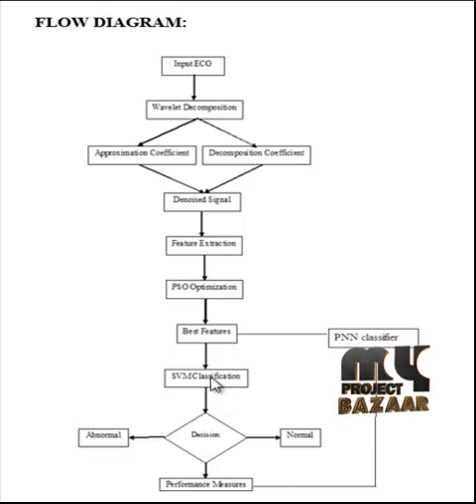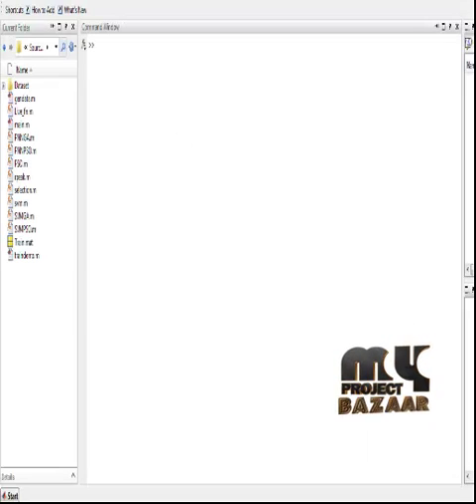For the classification process, two classifiers are used: SVM classifier and the PNN classifier, and the performances of these two classifiers were measured. For both classifiers, the decision is whether the input signal is normal or stress signal. From the values calculated, we measure the performance of the process based on accuracy, sensitivity, and the specificity of the classification process. Let me see the running procedure of the process.